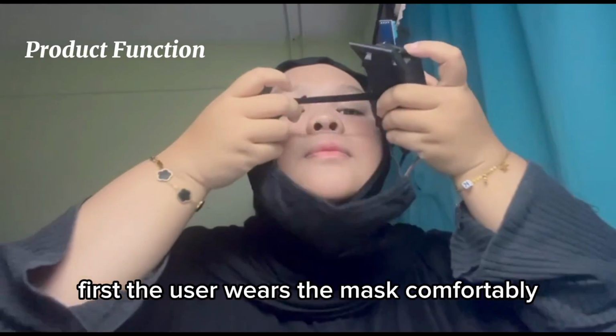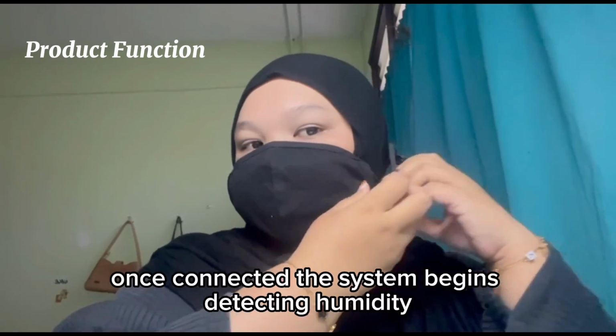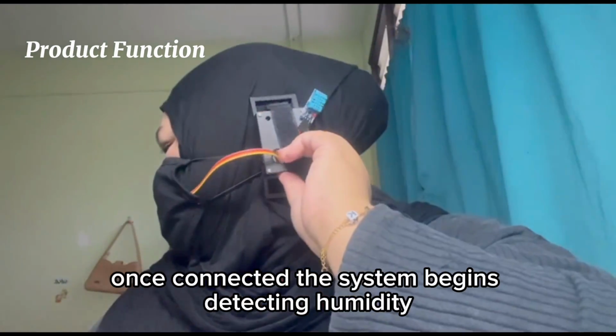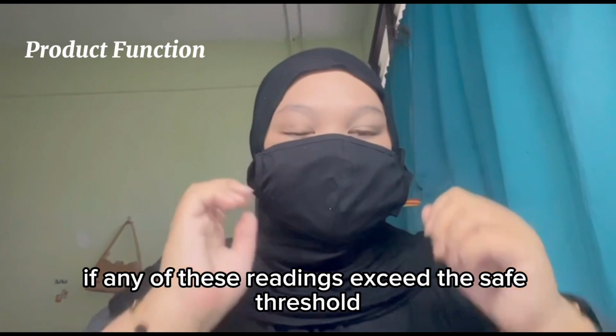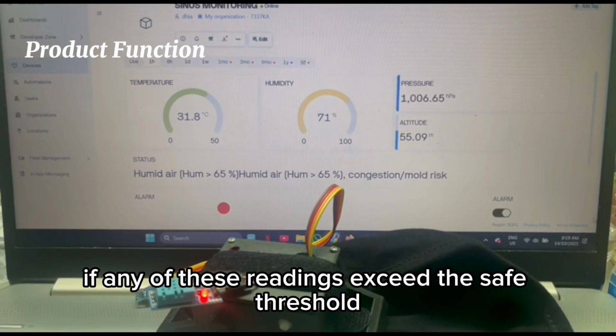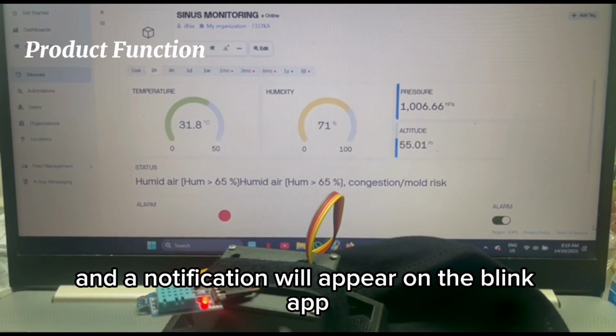First, the user wears the mask comfortably, and connects the device to the Blynk app. Once connected, the system begins detecting humidity, pressure, and temperature around the nasal area. If any of these readings exceed the safe threshold, the buzzer on the device will activate, and a notification will appear on the Blynk app.